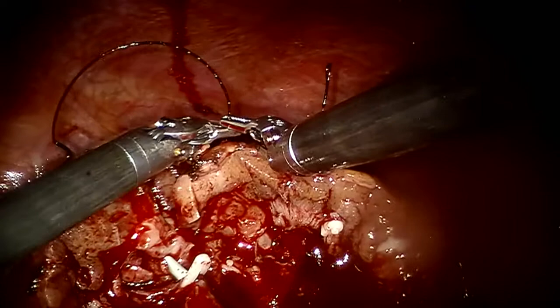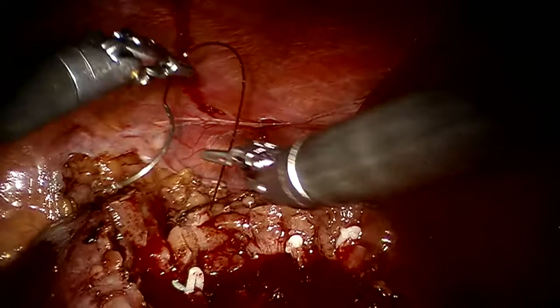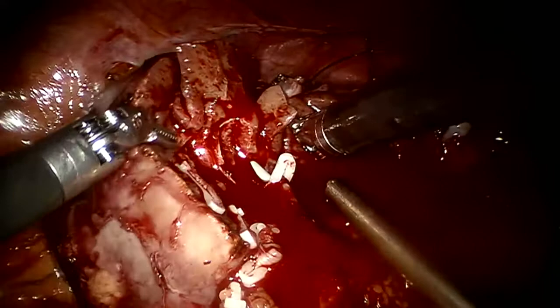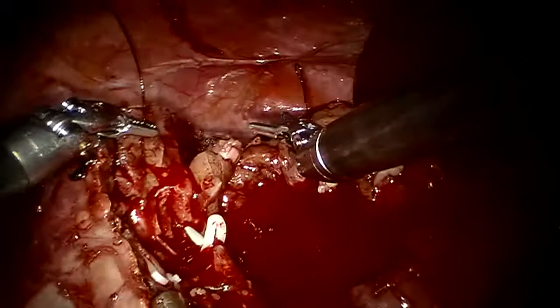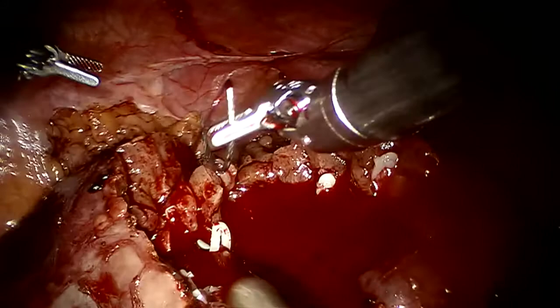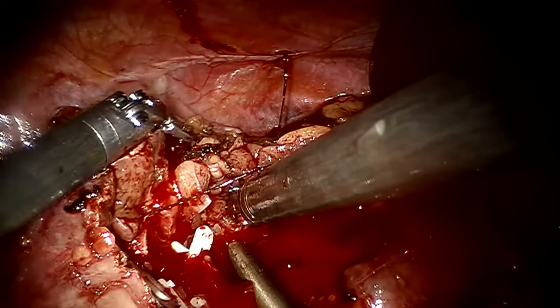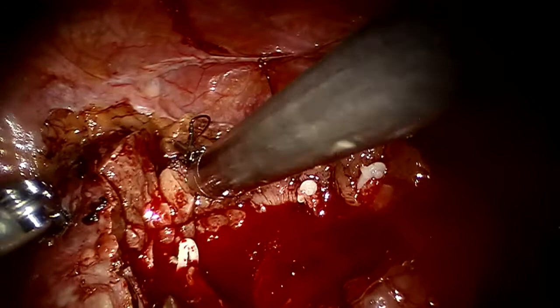That's because as one was doing the partial, one was being careful to clip in advance any larger intrarenal vessel that one would see. While it certainly takes 10 extra seconds per clip, when you unclamp, it gives you a huge savings in ischemia time. I have to do a lot of suturing still, but at least it's in the unclamped kidney now. And the ischemia time has been reduced significantly because of these clips.